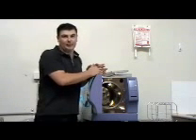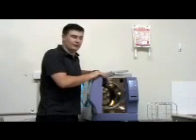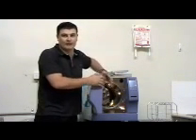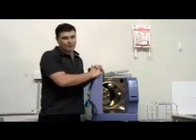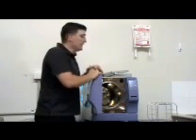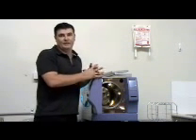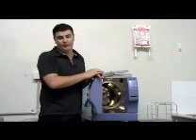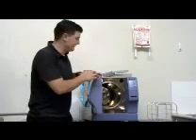We're ready to start the operation. Before we get into the operation, it's probably important to go through the maintenance of the sterilizer while we have the internal components out of the chamber. The units require minimal maintenance. The manufacturer recommends a routine procedure, maybe once a week to twice a week, to once a fortnight, depending on how frequently you are operating the sterilizer for your practice.